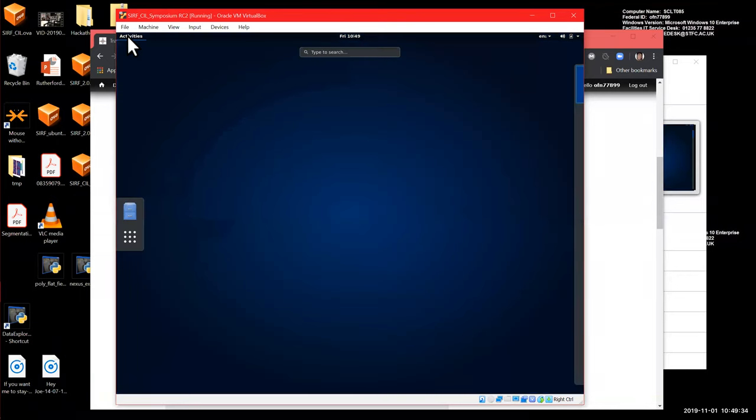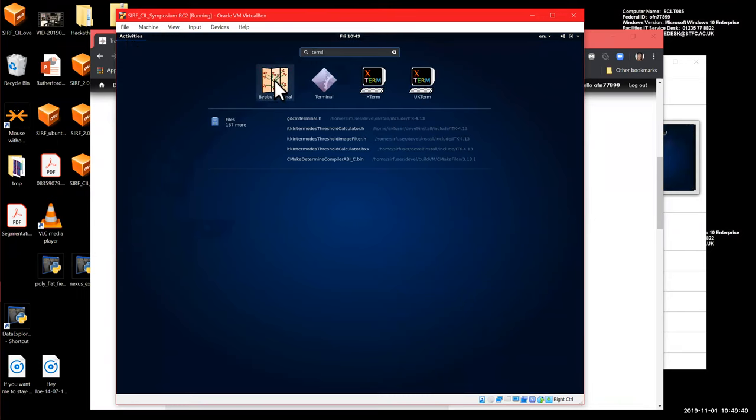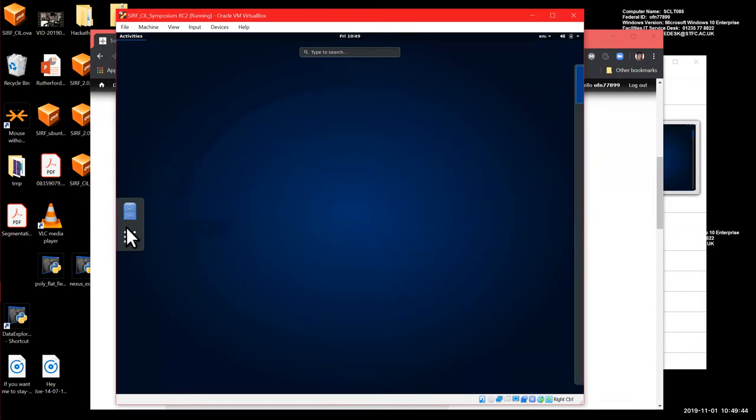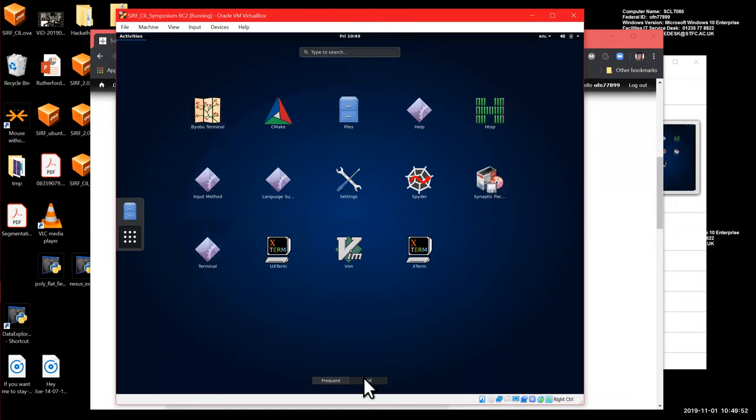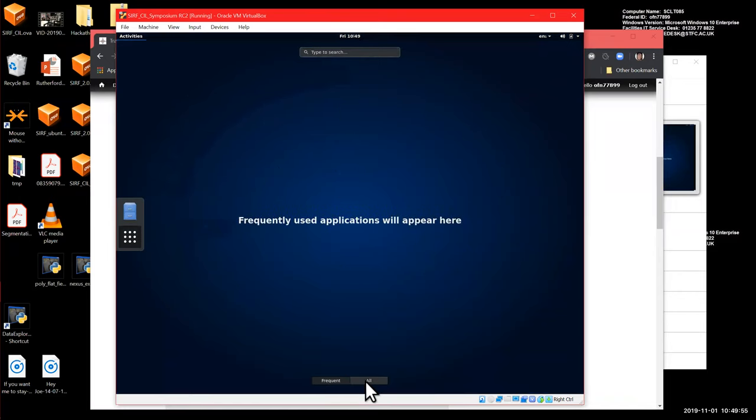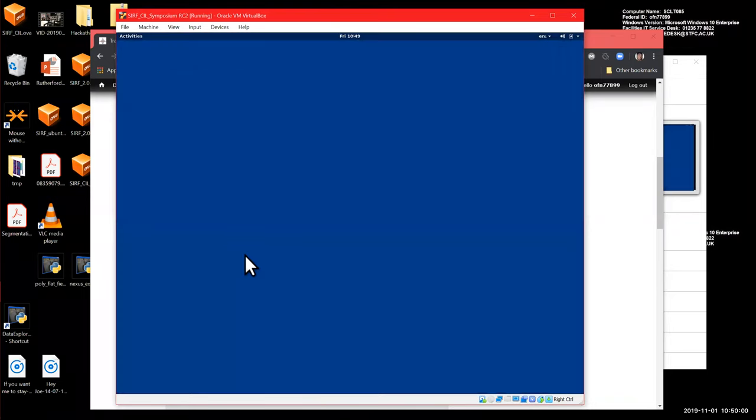And here you have activities that will be the applications installed on the machine. So you need to type terminal to get a terminal, which I normally use this one. You can use any other. The other option is to go here and see the icons and then click the one you like. And here you can also select all or frequent, but this is barely used, so this is all, so it's that here.